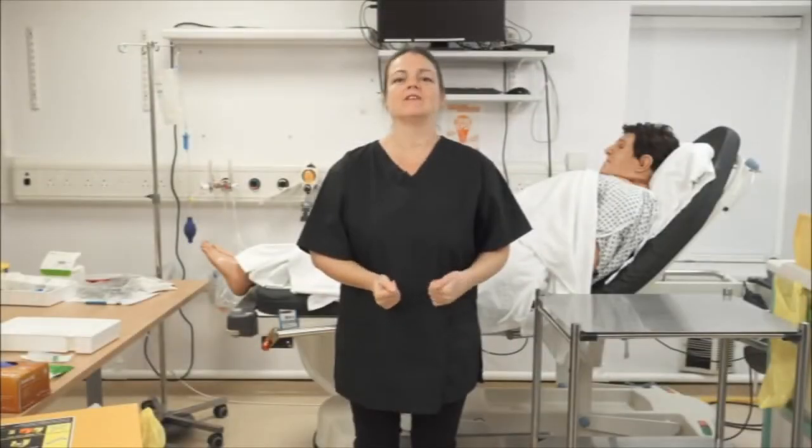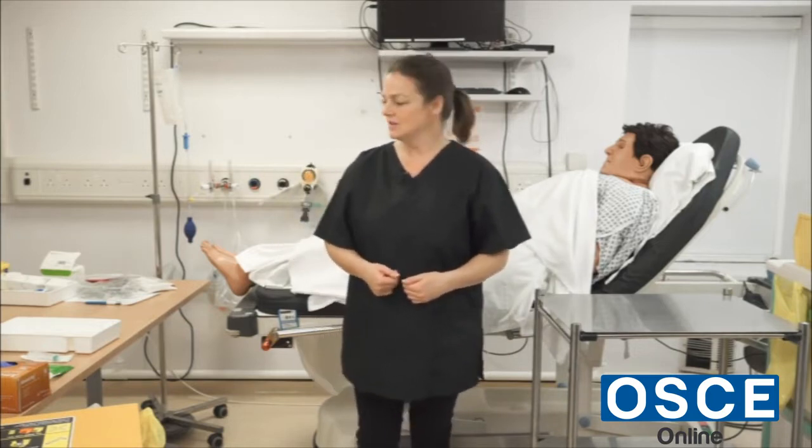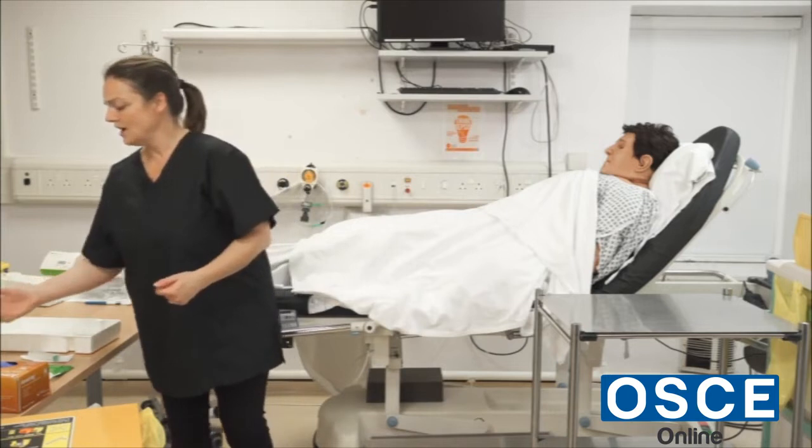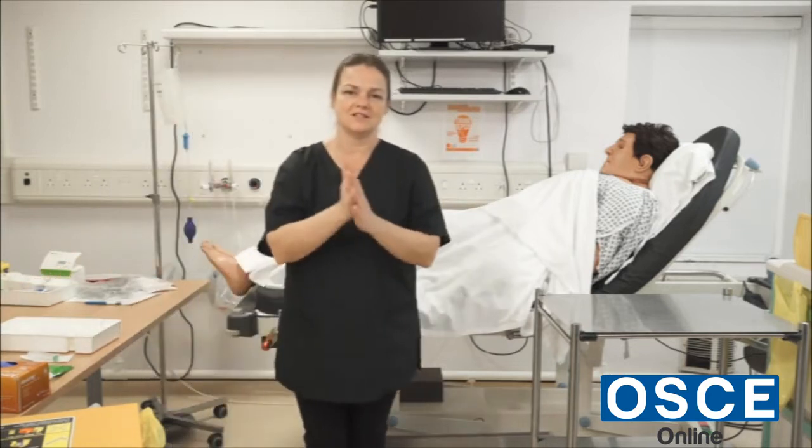This procedure is removal of catheter. They don't want you to do the full ID check — they just want you to acknowledge that the patient is the right patient and that the procedure is being consented for. I would ensure the area is safe to approach and do the seven steps of hand hygiene.